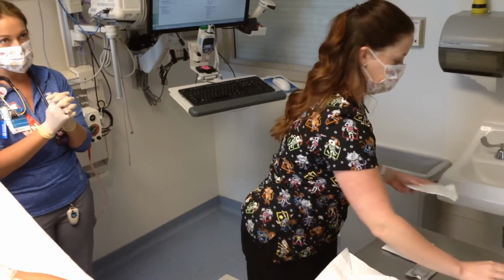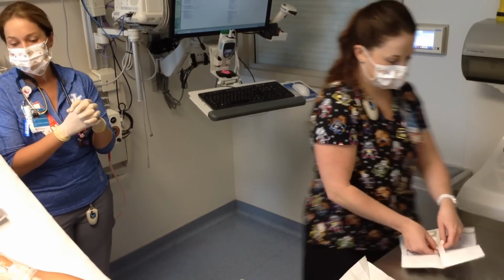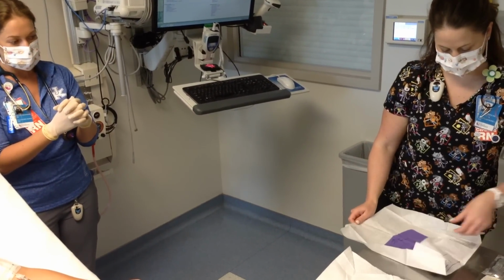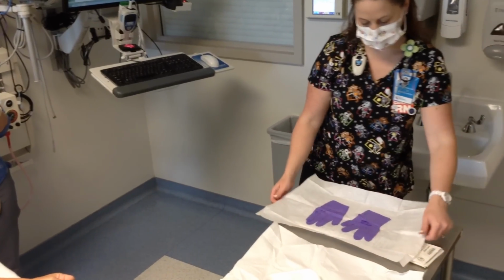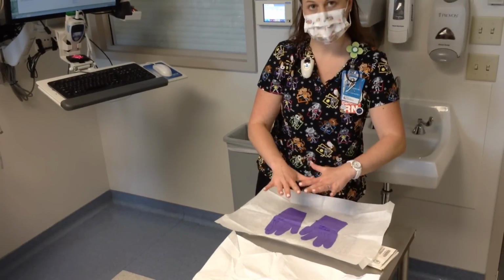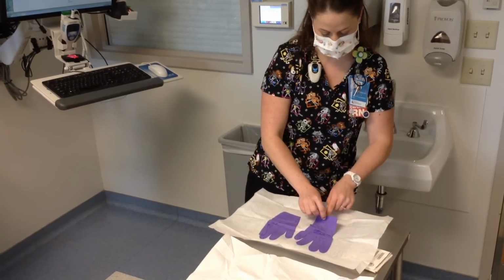So you want to use the sterile gloves you just removed from the kit. Make sure the glove packaging doesn't touch your sterile field. The thing about these packages, you don't want your flaps to fall back on, so make sure that you open them where it won't do that.